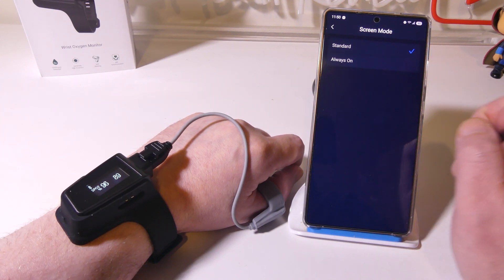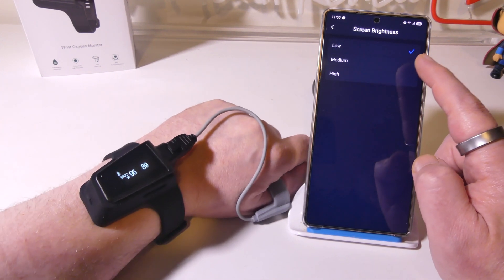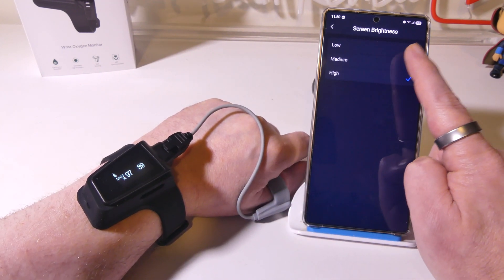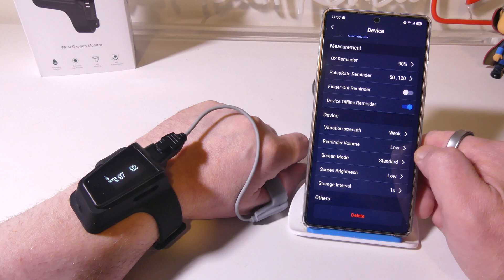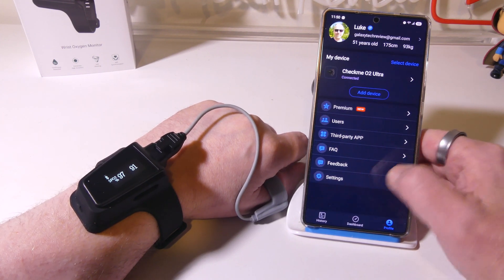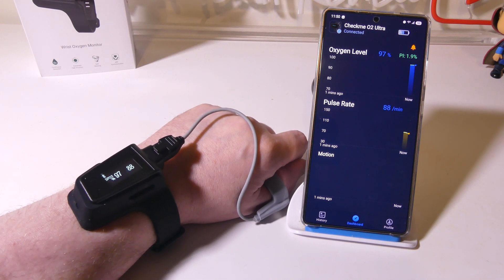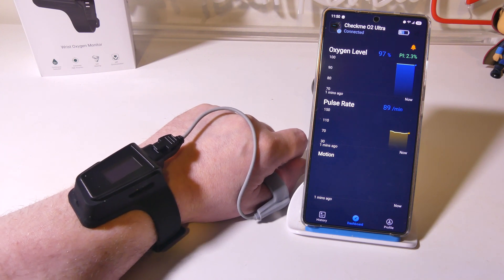Screen mode can be standard, which means it will time out over time, or always on if you always want it on. The screen brightness is automatically set to low but you can increase it — that will use a little extra battery life, but not too much with this small screen. There's a lot here that we can do to tweak this. You can also check your firmware version and reset to factory settings. This is great to have a nice snapshot of what my O2 and heart rate are doing over time, and I can monitor it with the app.